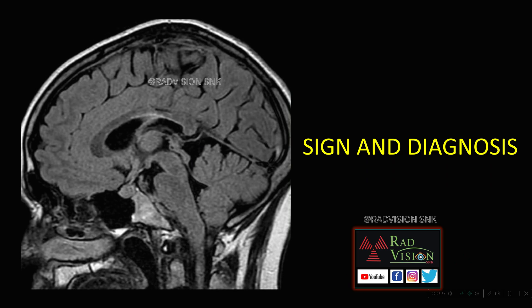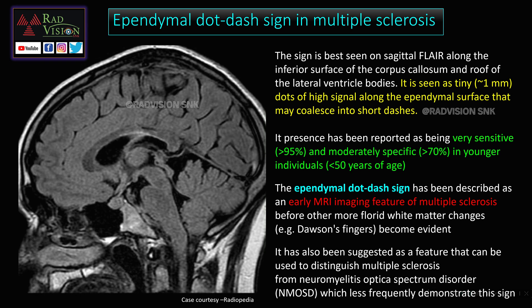Next case — you can pause the slide and guess the sign and diagnosis. This is called the ependymal dot-dash sign in multiple sclerosis. On sagittal FLAIR images, you can see multiple hyperintense tiny dots of nearly 1 mm that sometimes coalesce to form a line, classically seen along the ependymal surface of the ventricle. This sign is very sensitive — greater than 95% — and moderately specific — greater than 70% — predominantly seen in individuals younger than 50 years of age.